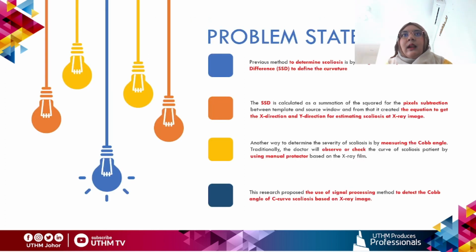The problem statement is that the previous method to determine scoliosis used the sum of square difference, which is SSD, to determine the curvature. The SSD calculates the summation of the squares for the pixel subtraction between the template and source window, and from that it creates the equation to get the x direction and y direction for estimating scoliosis in an X-ray image. Another way to determine the severity of scoliosis is by measuring the Cobb angle.